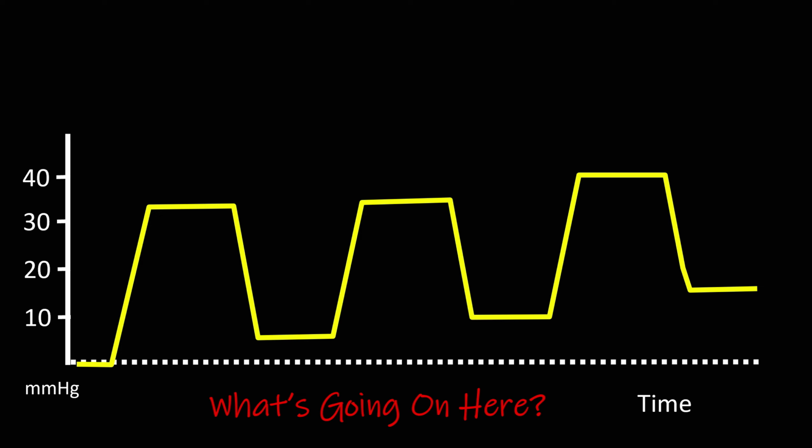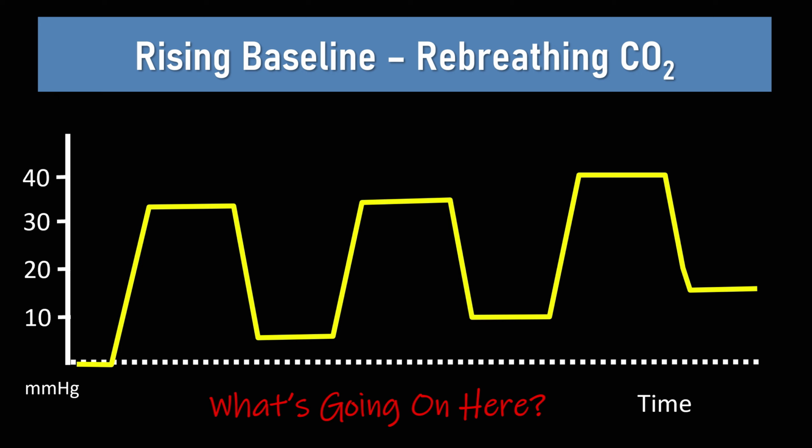Well, what's going on here? You can see something very unusual, which you should not see in any patient who has a CO2 monitor on them. What's going on here is you can actually see carbon dioxide on the inspiratory side of the waveform. Normally this goes down to 0 in inspiration, but it's not. It's climbing stepwise, and this is not good. This is a problem that is sometimes seen in the operating room, and when you see this rising baseline, this means that the patient is rebreathing carbon dioxide.